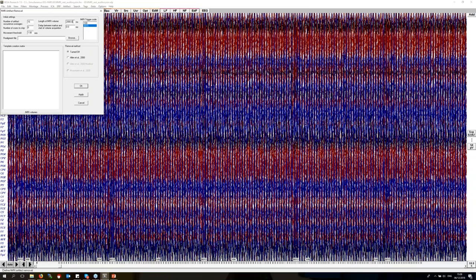First of all, there's the length of fMRI volume. I know the trigger spacing between the two different triggers, but sometimes the length of acquisition is less than the spacing between the triggers. So in this case, I need to adjust this. There may be a delay between the marker and the start of volume acquisition. And there's a trigger code that I use for this volume acquisition.